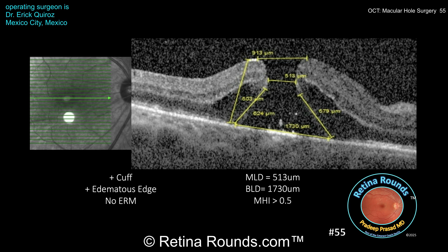Next, the edges of the macular hole are elevated, meaning there's a separation between the photoreceptors at the edge of the hole and the underlying RPE — we can say a cuff is present. Specifically, a cuff is when the edge of the hole is elevated more than 200 microns from the RPE, and that appears to be the case here, conferring a higher likelihood of closure. The edge of the macular hole also has cystic or hydrated changes, which too carry a higher likelihood of closure. There's no ERM or epiretinal proliferation, which can decrease the likelihood of closure.